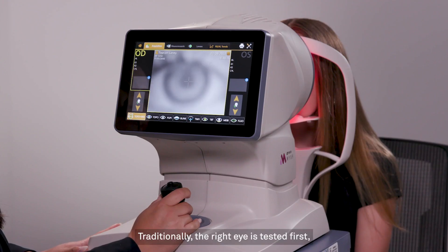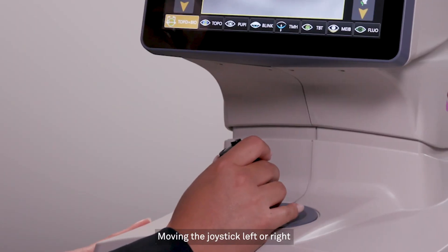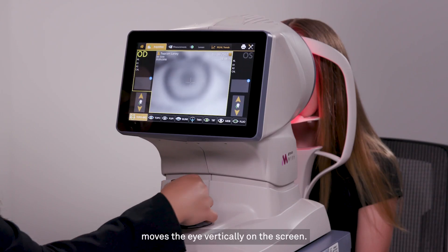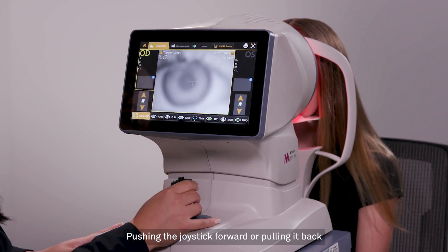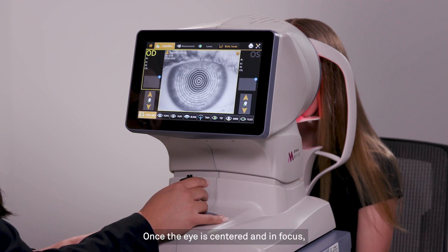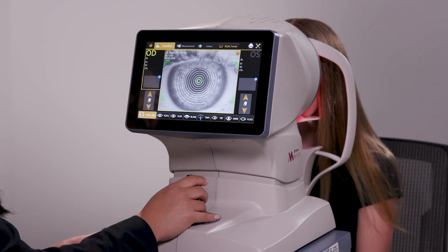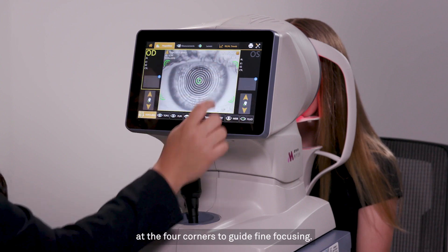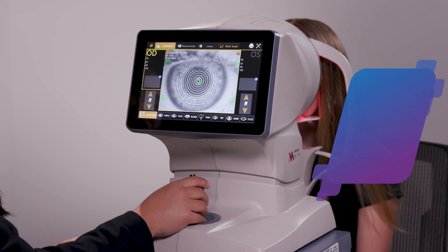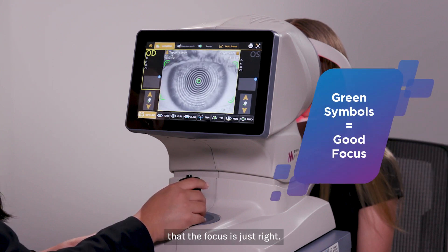Traditionally, the right eye is tested first, but you can start with either eye. Then center and focus the eye on the video screen. Moving the joystick left or right moves the eye horizontally in the video screen. Rotating the joystick clockwise or counterclockwise moves the eye vertically on the screen. Pushing the joystick forward or pulling it back focuses the eye. Once the eye is centered and in focus, push the button on top of the joystick once. Symbols will appear on the screen at the four corners to guide fine focusing. Red arrows indicate that you should push forward slightly. Blue arrows indicate that you should pull back slightly. Green arrows indicate that the focus is just right.